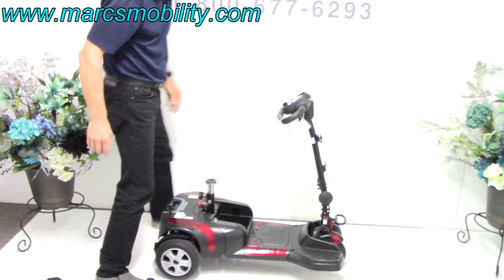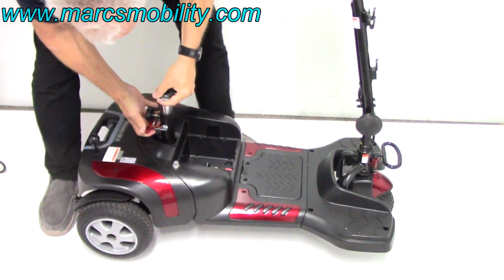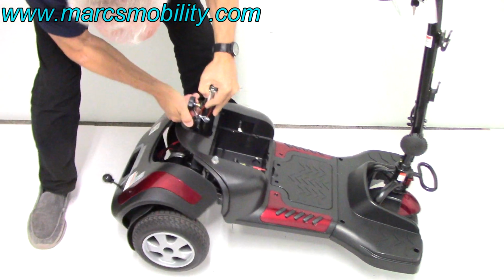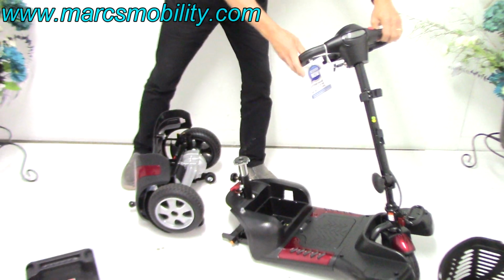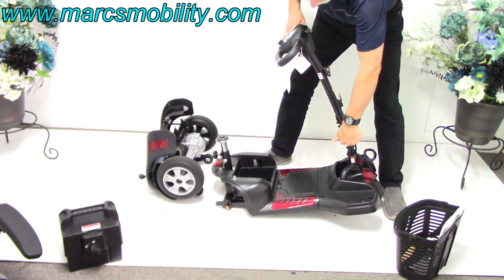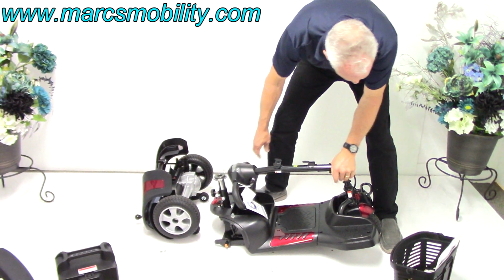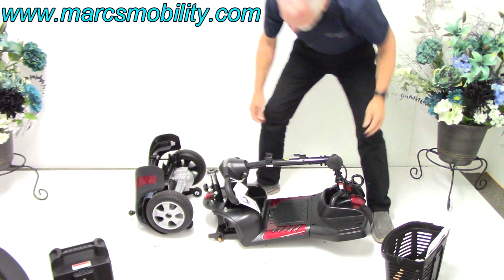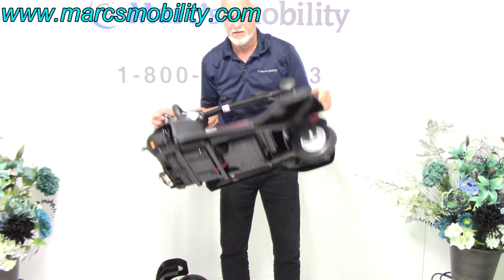Then over here, you've got a lever here. You can pull it up. Look at that. And it comes apart like this, okay? So now you've got your front end. I'm going to lower this down. This is called a tiller. So if you're going to load it in the car, you would lower the tiller, okay? And when you're ready to put it in the car, you can grab it by the pole and by this.